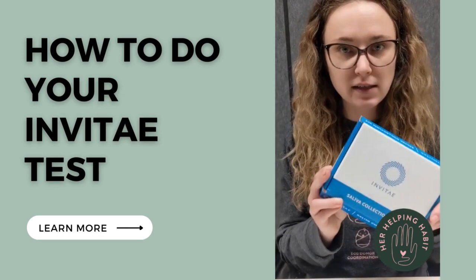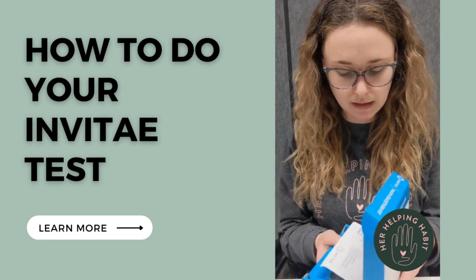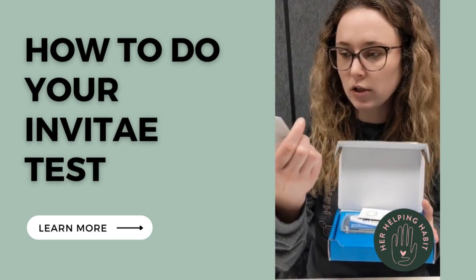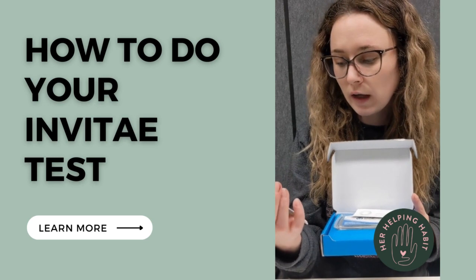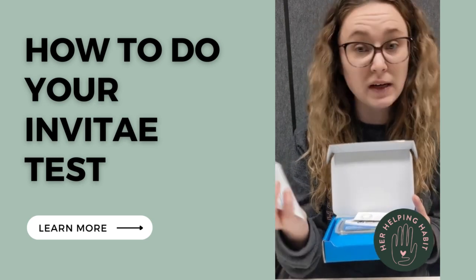When you get your test it's going to come in a box like this, and when you open it there's going to be two pieces of paper on the top. There's one with your instructions that tells you everything inside: an instruction card, a saliva tube, patient information card, clinical bag for FedEx, airway bill, and a specimen bag.